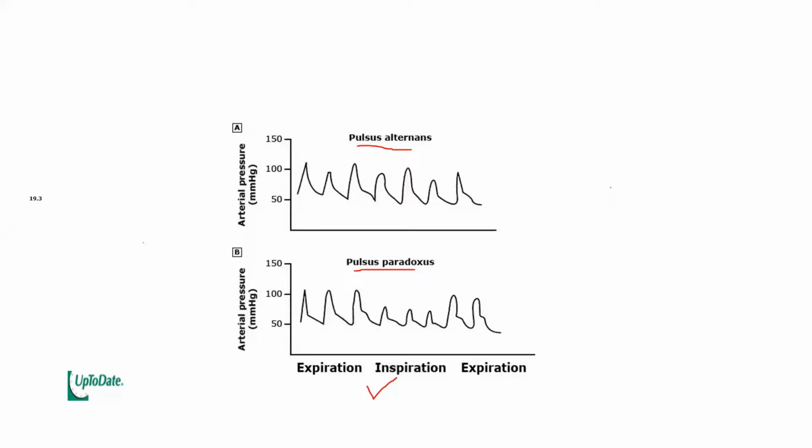Because of tamponade. Here, you look at the pressure. That's expiratory pressure. Look at the inspiratory pressure. It goes so low. And again, expiratory pressure recovers. So during inspiration, the arterial pressure drops. So this is pulsus paradoxus of severe tamponade, okay? So the difference here between this one and this one, because it's a source of confusion, this is beat to beat, but this is respirophasic.